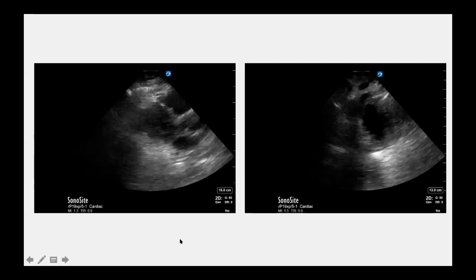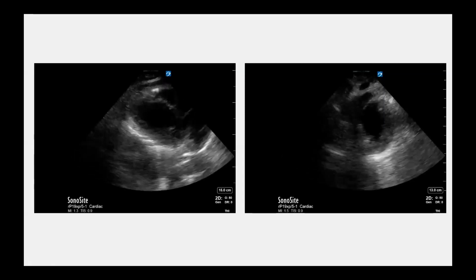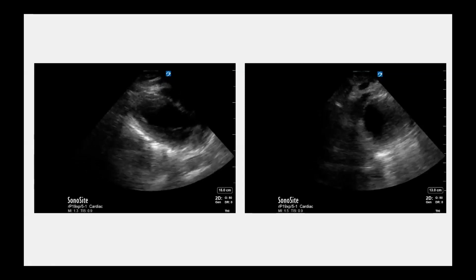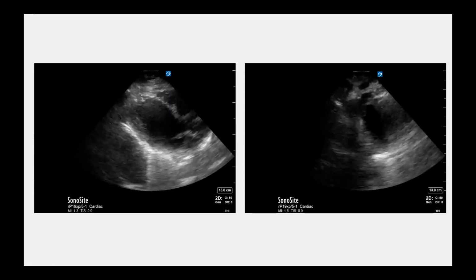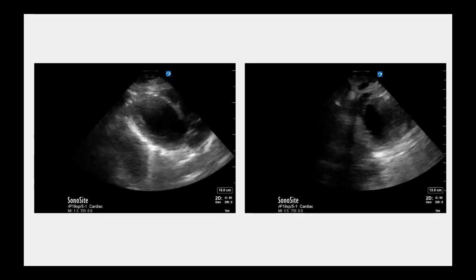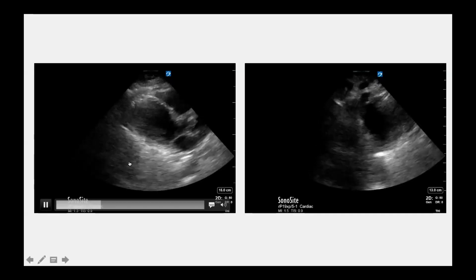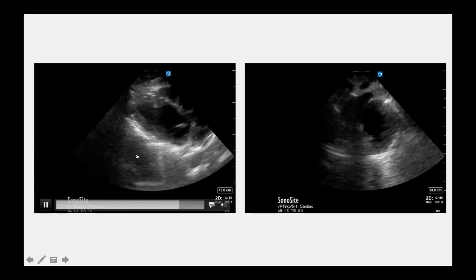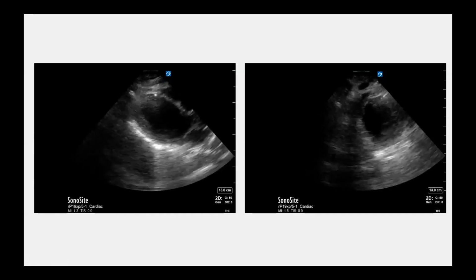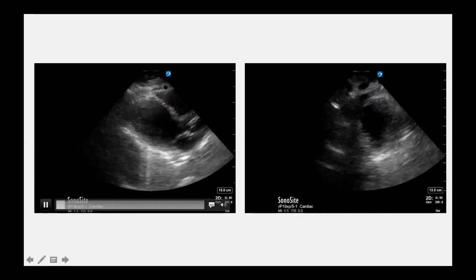It's parasternal long. Any other comments regarding the image itself? Look at the chambers. Image on the left. Is it a mild pericardial effusion, or other than that? No, there's no pericardial effusion. Are you talking about this? The one on the top, all the way in the top when the image moves right over. Somewhere around this area. This thin line, that'll be an epicardial fat pad.